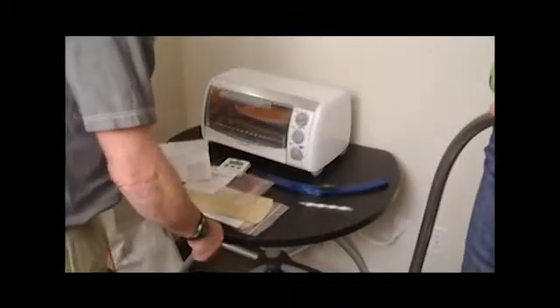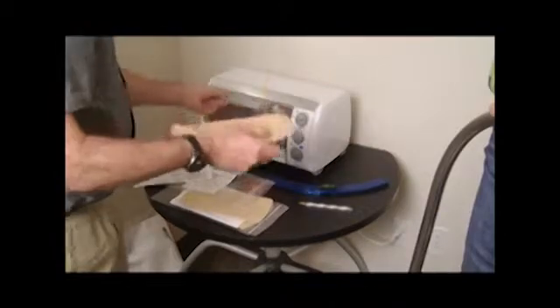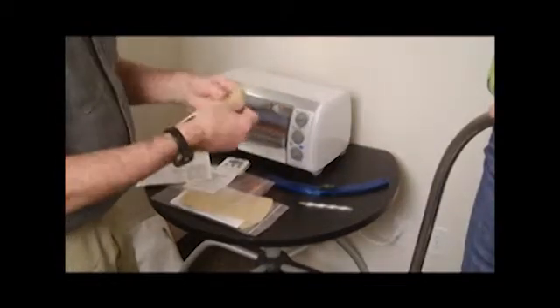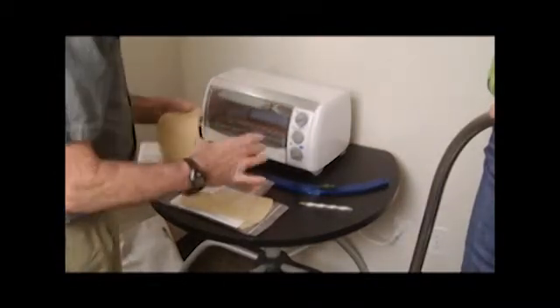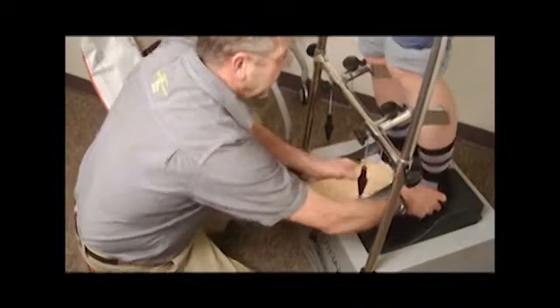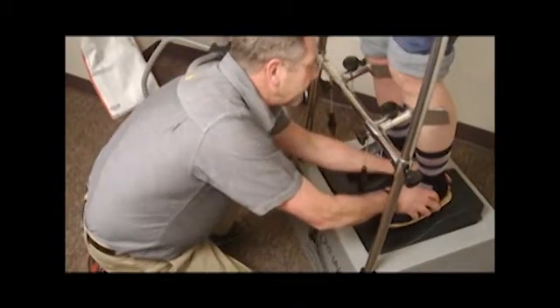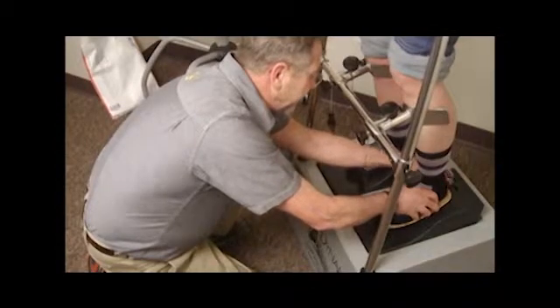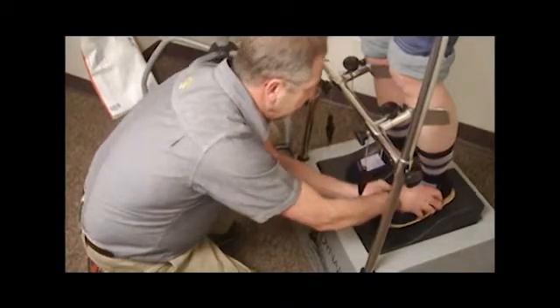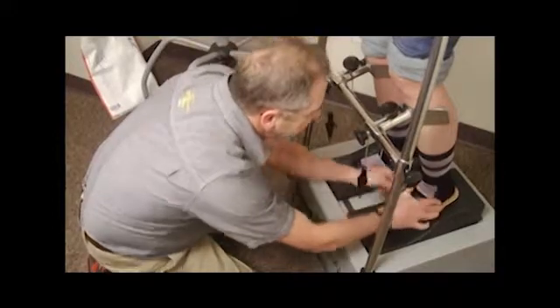So my timer has gone off. Stop the timer. Take the impression core out of the oven. You see that it's quite warm, very, very pliable. I'm going to start the timer for 1 minute again. So lift your left foot up for me. Now I'm going to position the impression core so that the heel is just about 1/4 to 3/8 of an inch from the back edge of the core. And the big toe joint is at the transition in the pillow.